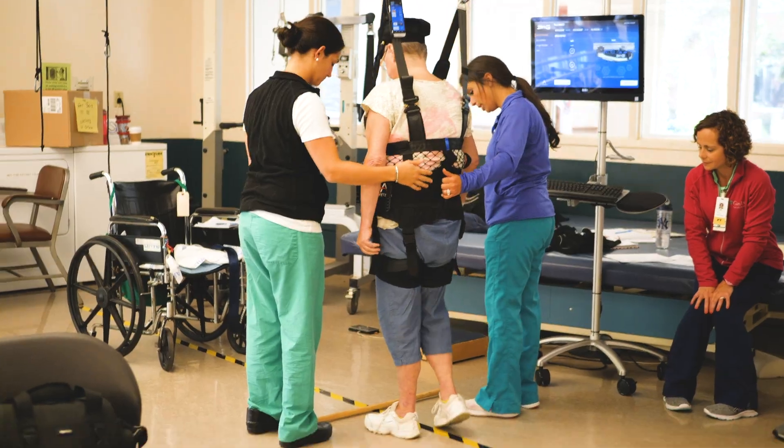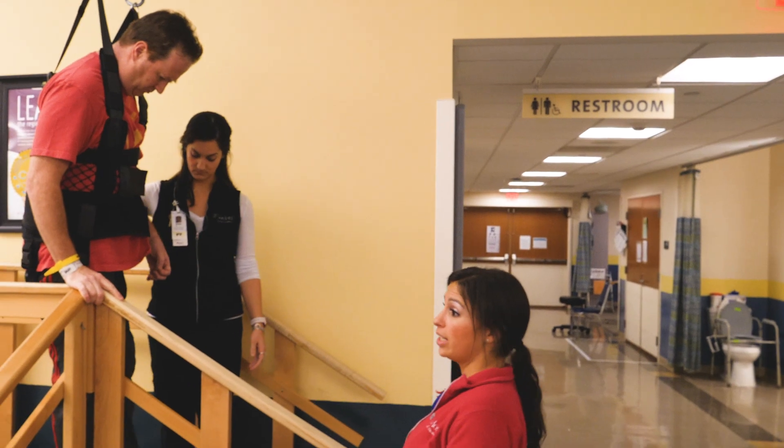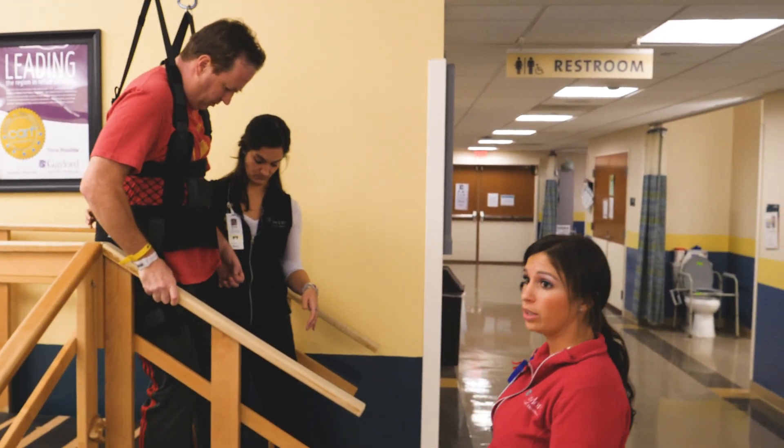I'm Kaitlin Rudolph, one of the inpatient physical therapists here at Gaylord Specialty Health Care. With the Zero-G you can work on higher level balance activities and functional mobility tasks such as gait training or stair navigation. Our occupational therapists also use it for home management tasks like reaching down to pick up an object from the floor, carrying a laundry basket — all those things that patients will need to be able to do.